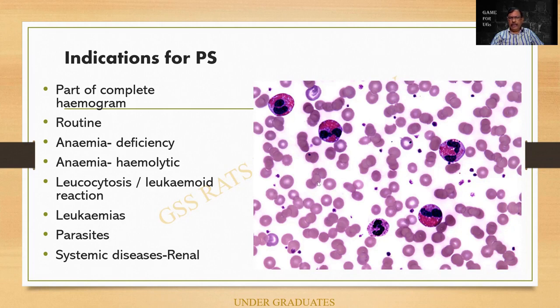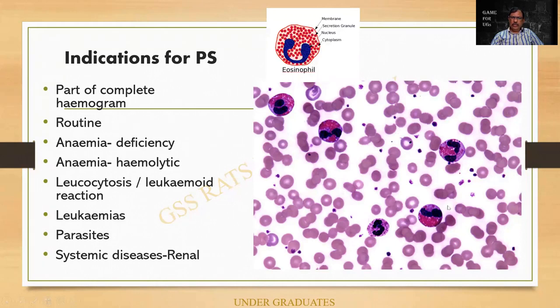I hope you people have made a diagnosis of this — it is an eosinophil. So many of them are there. We identify it not only by the bilobed nucleus but also by the brick red granules. In fact, the more important point will be the brick red granules.